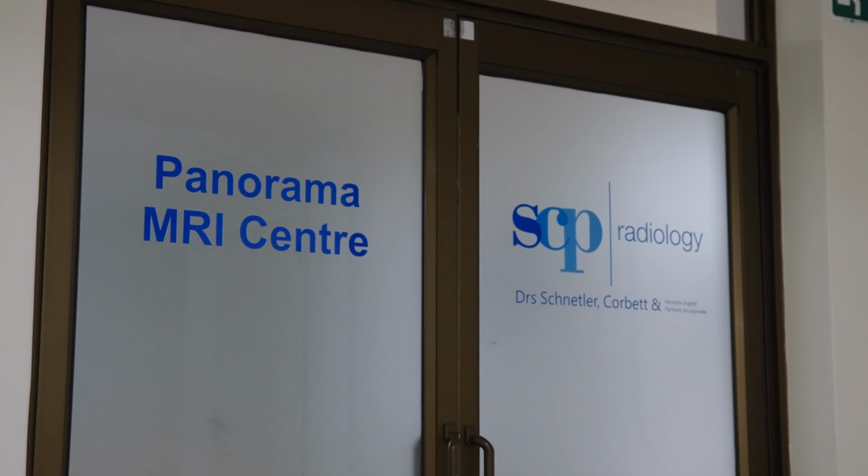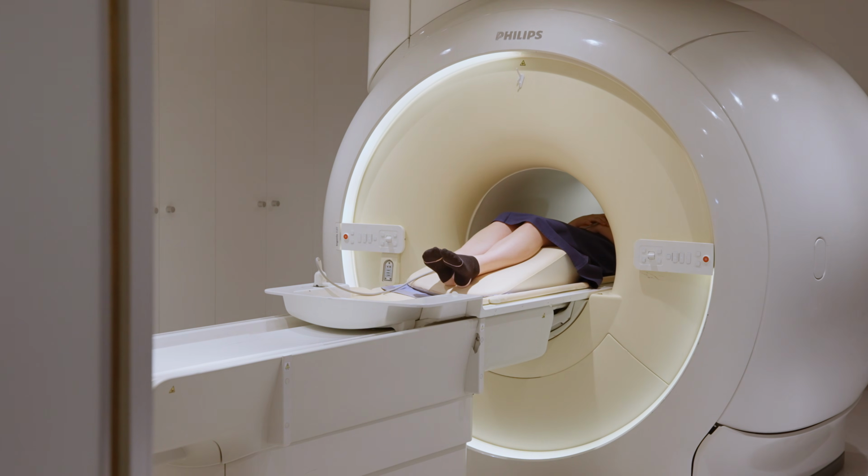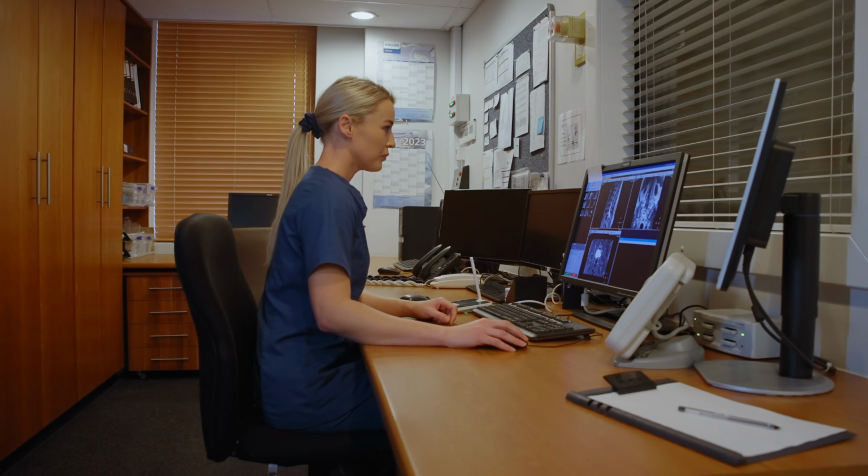So generally, we're able to confirm a diagnosis and find out a cause for a patient's back pain, whether that's related to degenerative spinal disease or whether they have an underlying tumor or evidence of infection. Those can be teased out on MRI, and subsequent to that, doctors can decide whether they're going to manage the patient conservatively or whether the patient may need surgical management for the underlying condition. And subsequent to that, it can also be used in follow-up to see if symptoms recur, whether a cause for that can be identified or whether any complications of intervention have occurred.